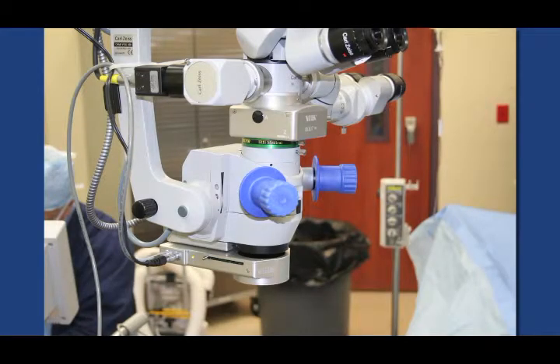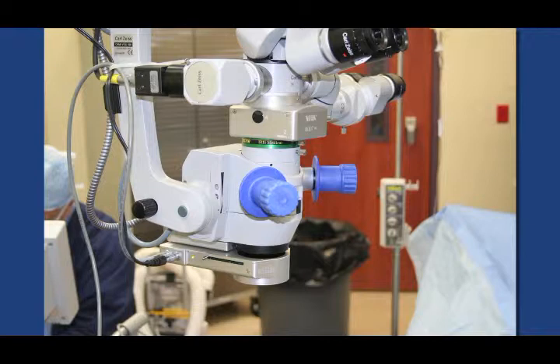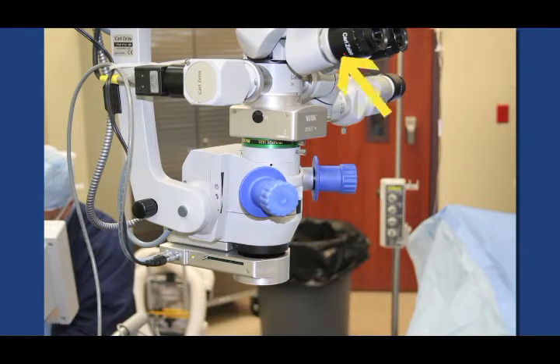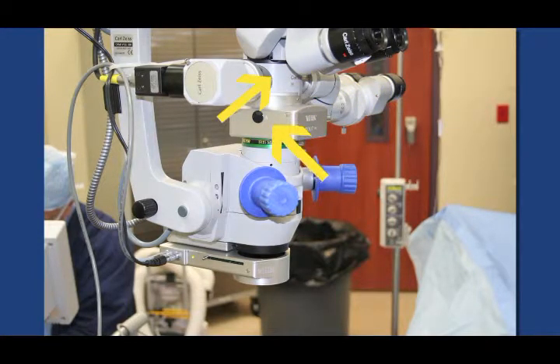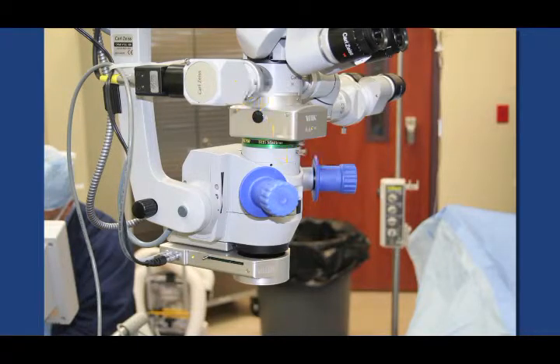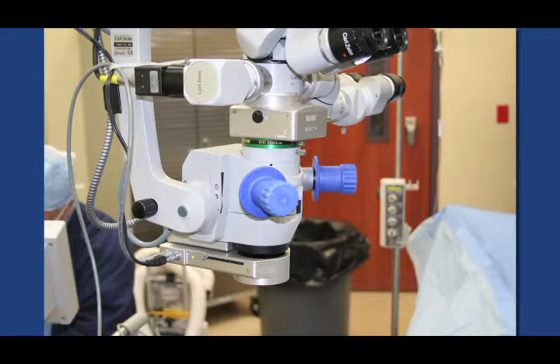Some microscope manufacturers, such as Zeiss, have shared optical paths. This means that both the physician's oculars and the assistant's oculars use the same optical paths. A beam splitter is used to provide the microscope's image to both the physician and the assistant. In such a case, if the assistant does not require a re-inverted image, then install the Rolls Infinity as close as possible to the physician's oculars.